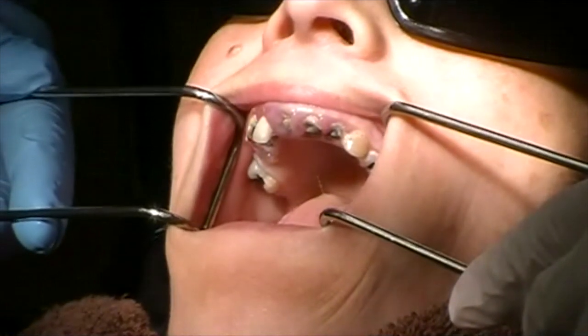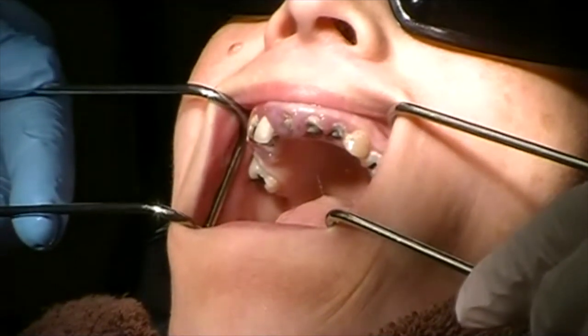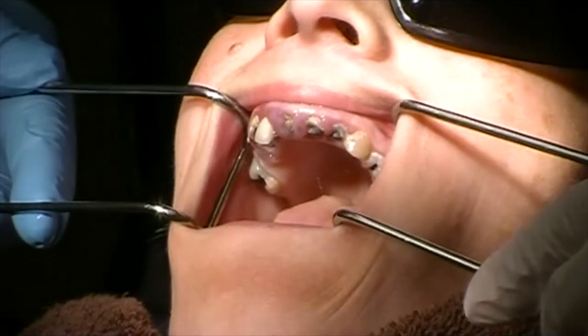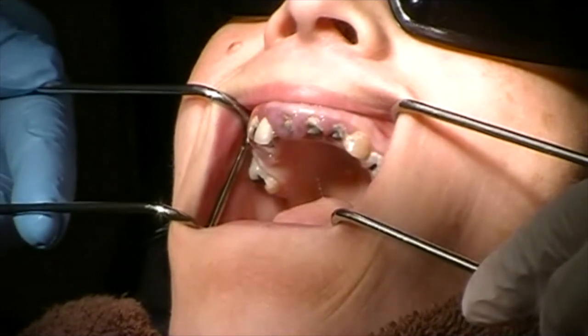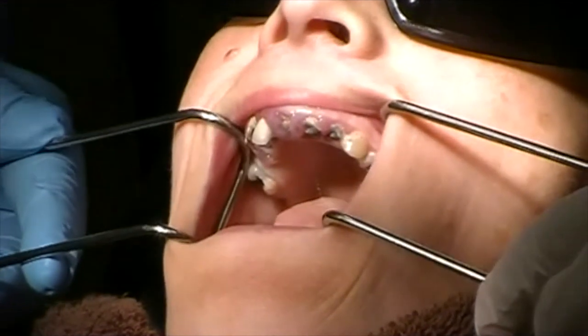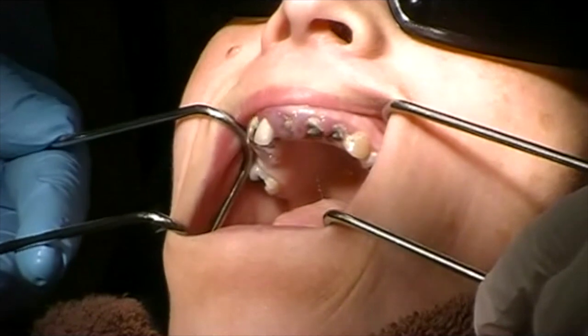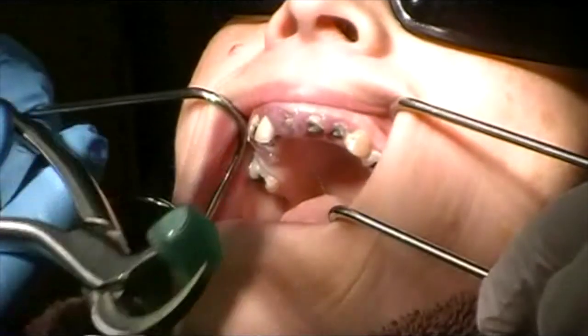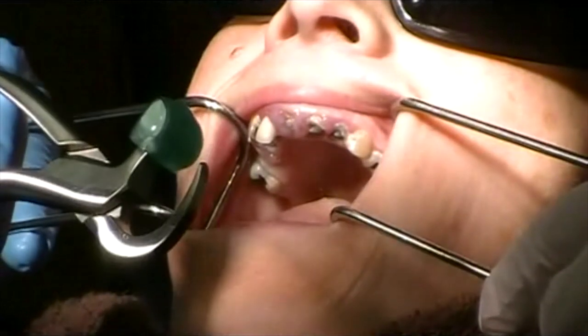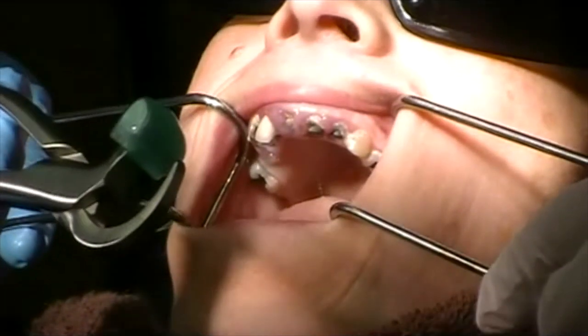The first thing I'm going to do is take a burr on a high speed and flatten the palatal surface of each of the roots. This allows me to have a purchase point for the physics forceps. There are several designs of the physics forceps — we have a maxillary anterior design, a maxillary right, and a maxillary left design.